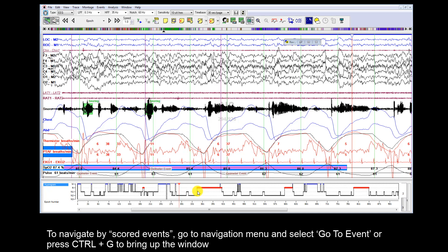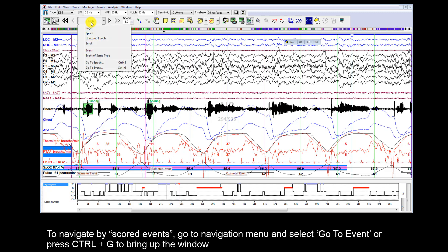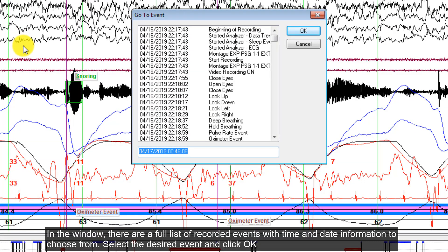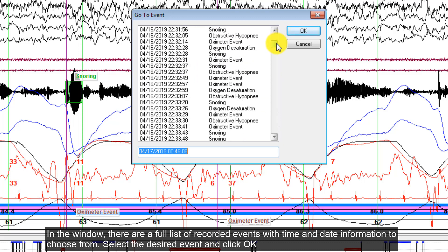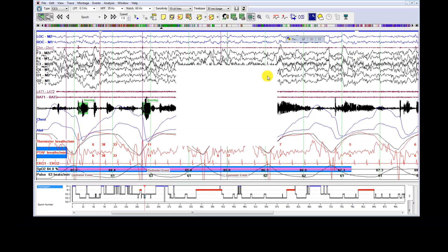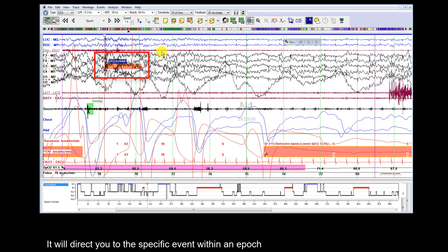To navigate by scored events, go to the Navigation menu and select Go to Event, or press Ctrl+G to bring up the window. In the window, there is a full list of recorded events with time and date information to choose from. Select the desired event and click OK. It will direct you to that specific event within the epoch.